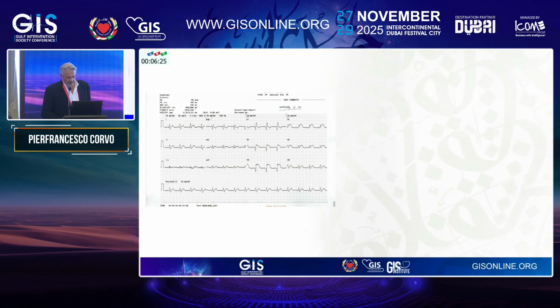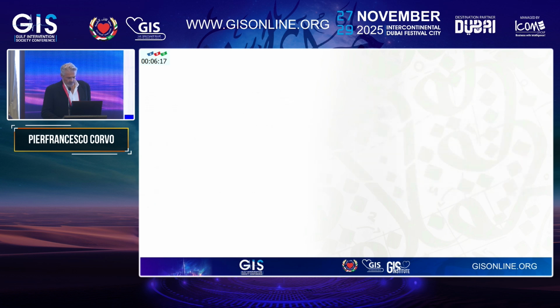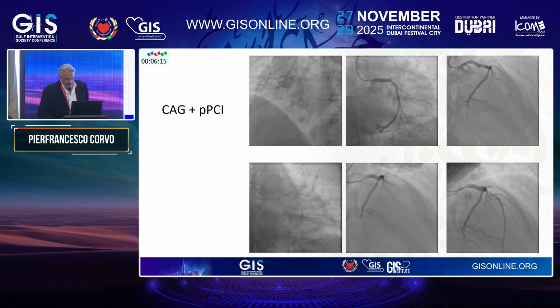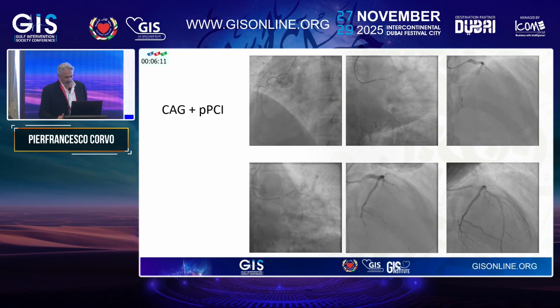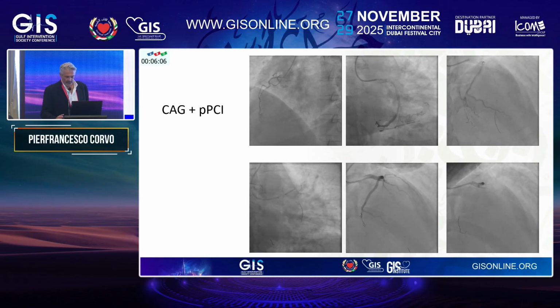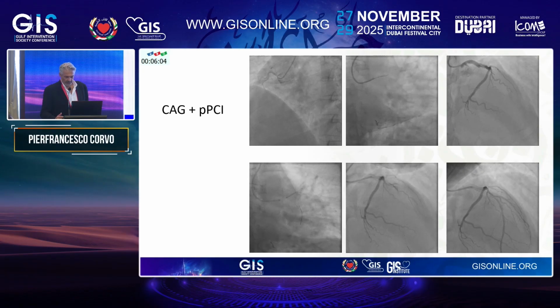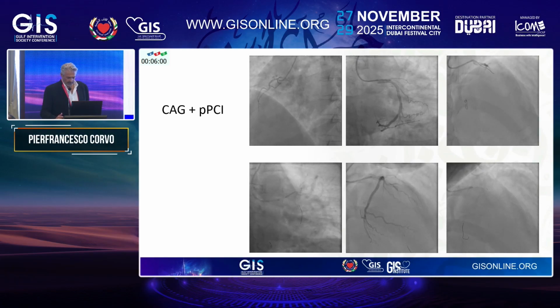When the patient arrived, two subsequent ECGs showed a clear ST elevation with right bundle branch block, so the cath lab was activated. The CAG, as shown here in this series of runs, showed a non-dominant RCA with a dominant left circumflex, with occlusion of the ostium of the LAD. The patient at the time was relatively stable.